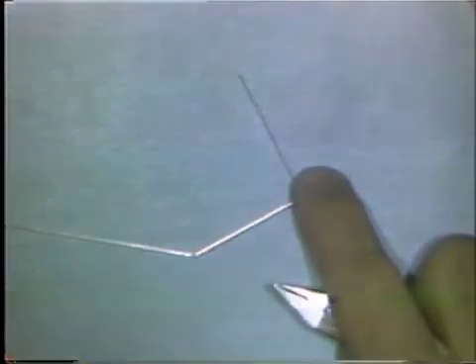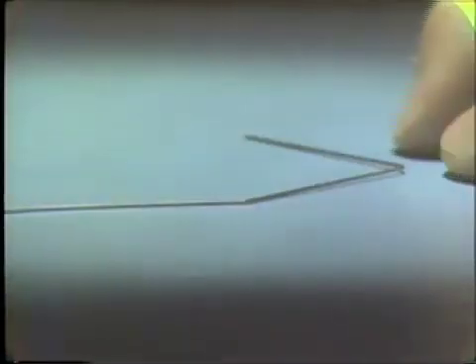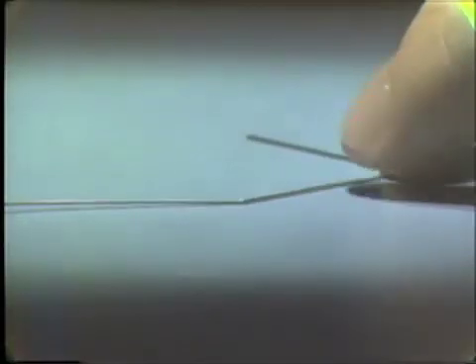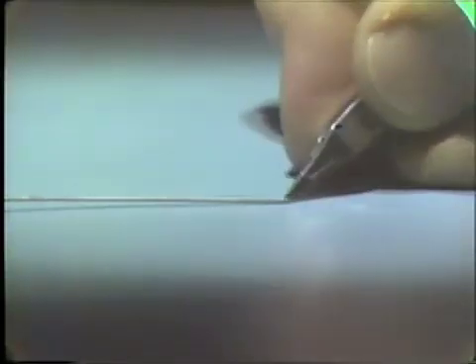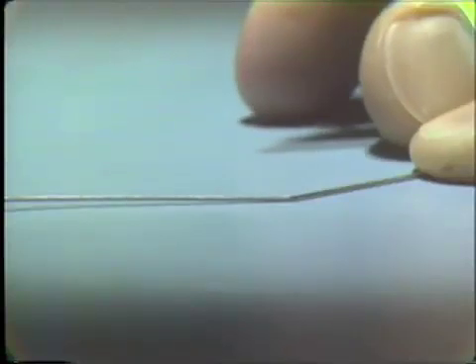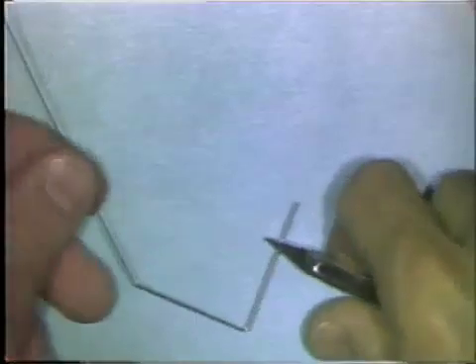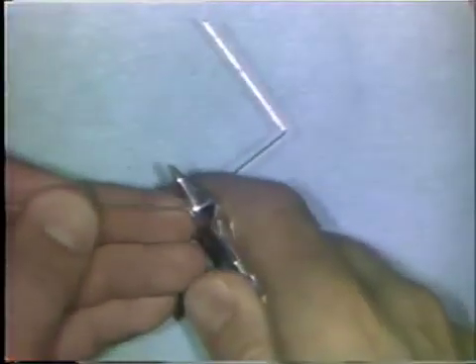Now, from a side view, you check flatness by holding the corner that you've already bent, the right angle bend, down, and observing if the section you've bent leaves the table. It does leave the table slightly, so an adjustment bend will have to be made to bring it into the same plane of space as the rest of the wire. And this is done by placing the plier over the wire.